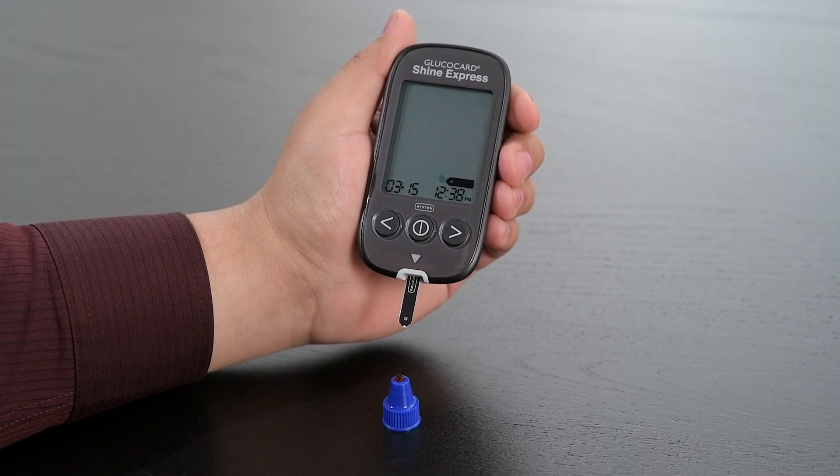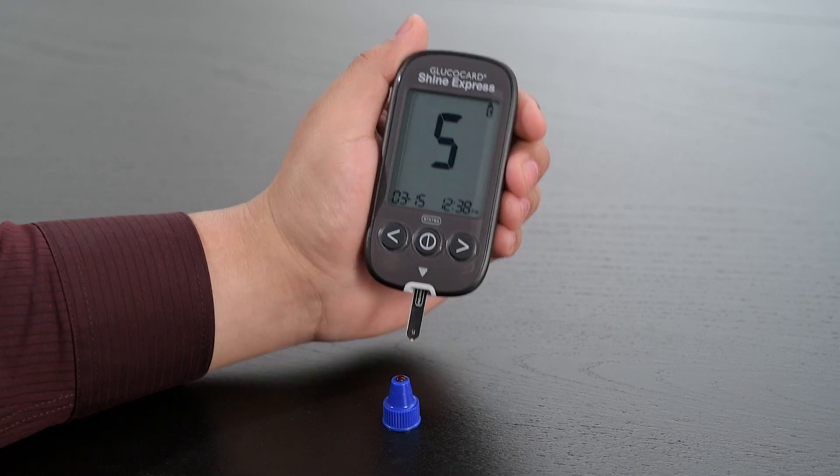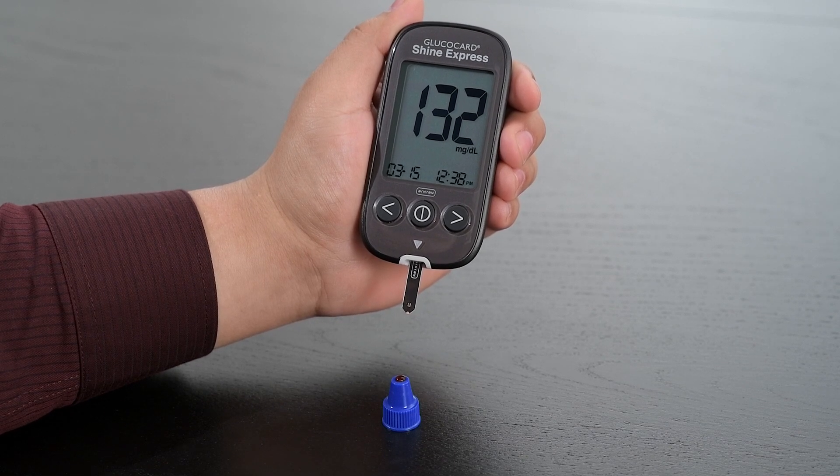Now apply the control solution to the narrow end of the test strip until the meter beeps or begins to count down. Once the meter has finished counting down, the control solution result will appear and the meter will announce this result. The control solution test is now complete.